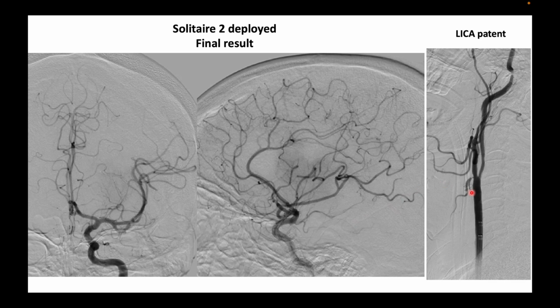And on our way back, we took a shot of the carotid artery, and we saw that this was also patent and it was holding well. We waited for 10 minutes, took the injections again, and it was still holding well. So then we did not stent the carotid.